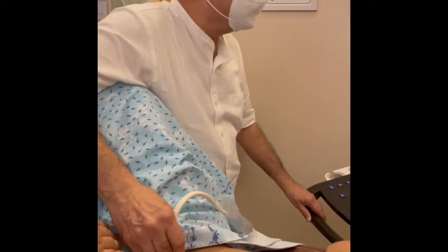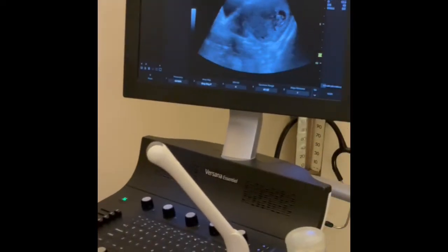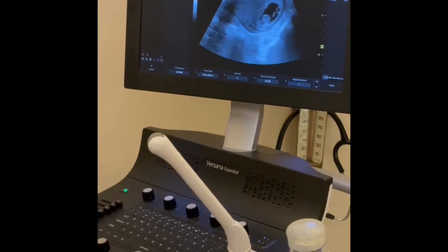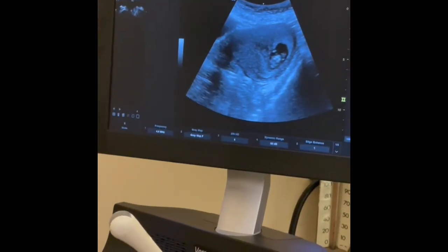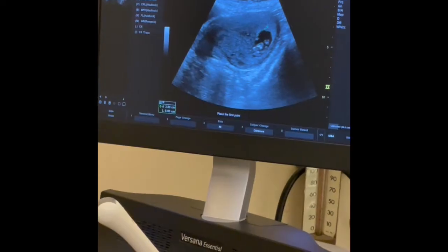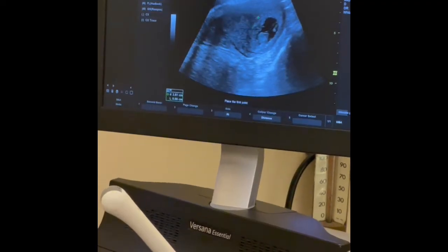So you have to orient the procedure. The bladder is not so adequate, but you can see the cervical canal and then the chorionic frondosum where the cursor is — it's frontal. So our route is going to be straight and up like this.